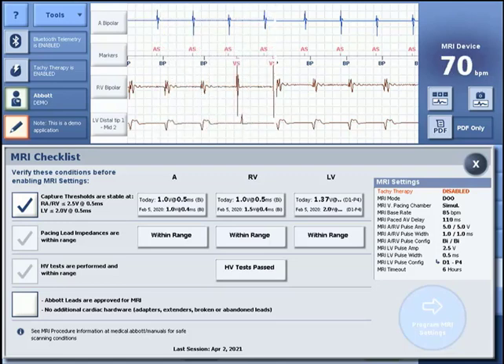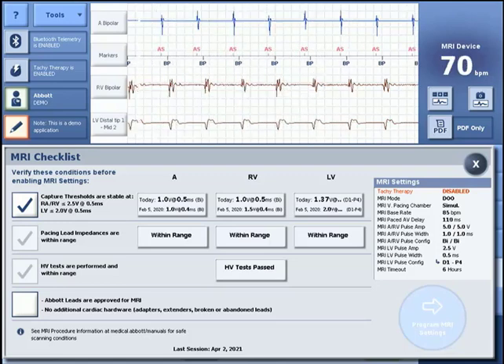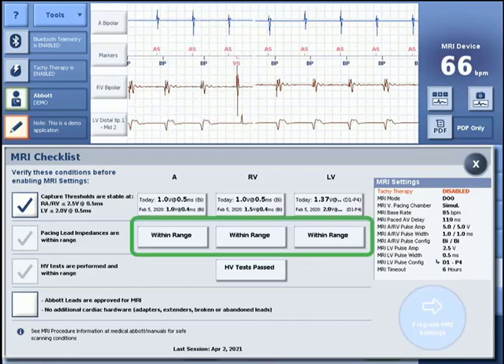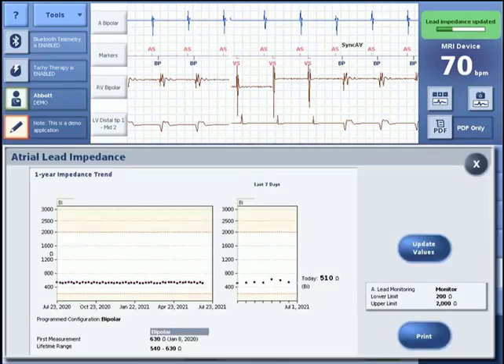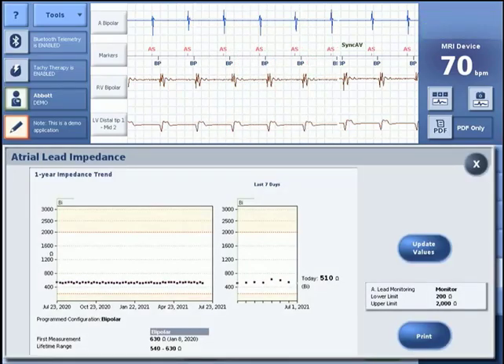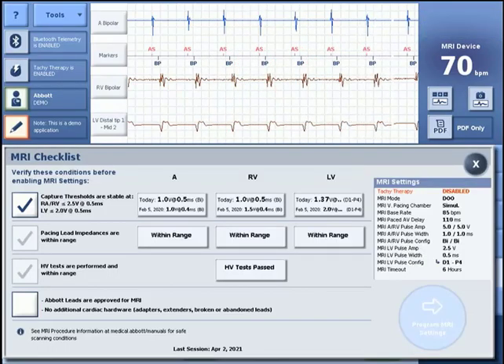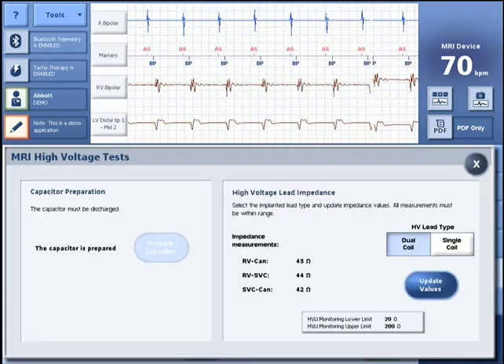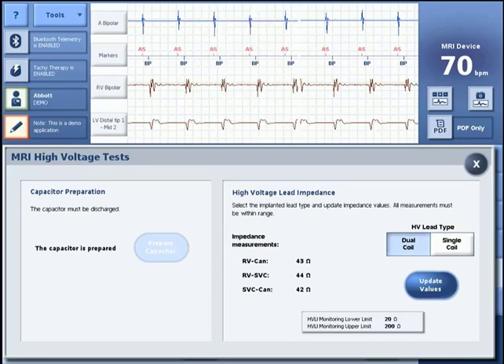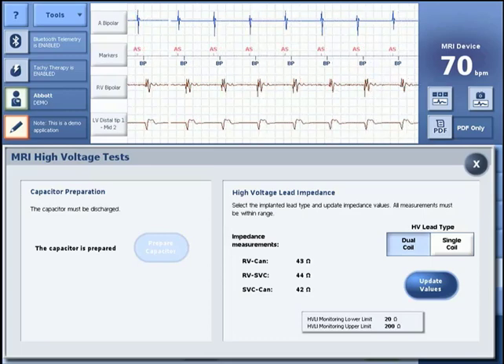Once the capture thresholds have been verified, check the box on the left side of the MRI checklist. To view the pacing lead impedance trend or update the impedance measurement, tap on a within range box and press Update Values to perform a new impedance measurement. The MRI high voltage tests are also performed automatically. To view the tests, press the high voltage test box. If the capacitor has already been prepared, the button will be grayed out. All of the high voltage lead impedance measurements will also be displayed.